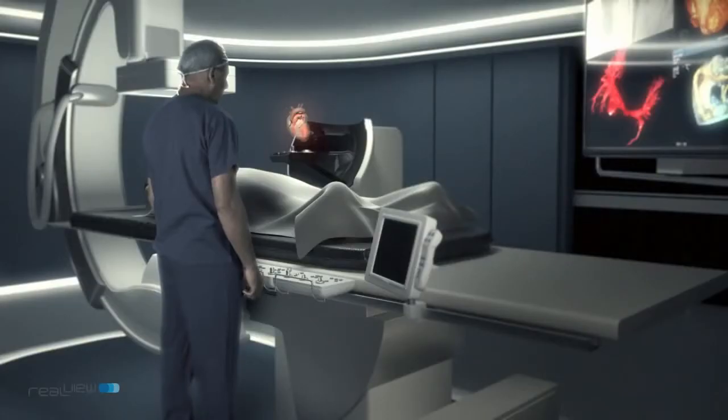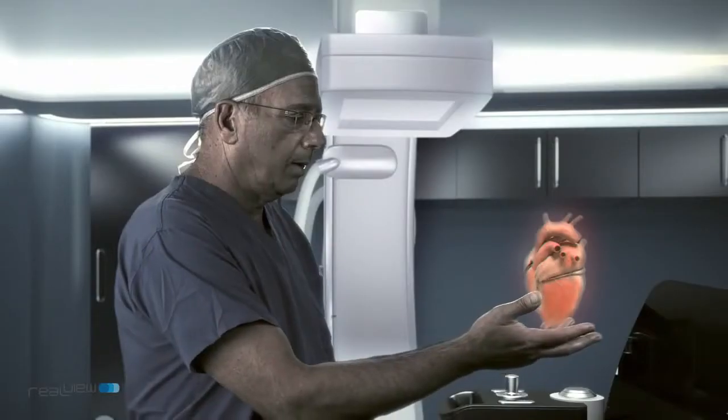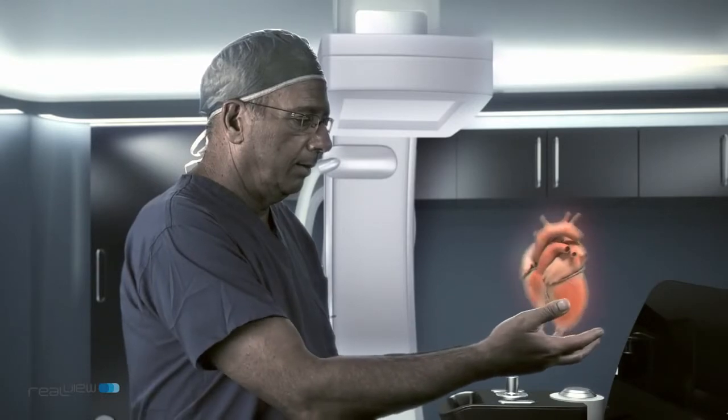There is no doubt that medical holography will play an important role in the medical imaging industry over the next few years. We are currently in the process of introducing this fascinating technology into the field of interventional cardiology.